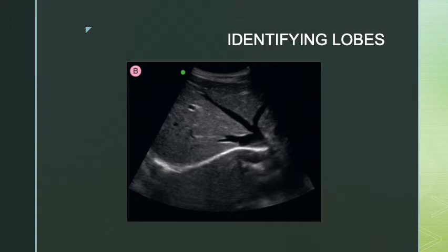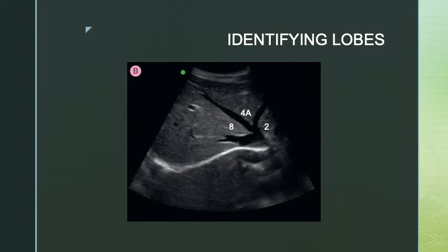You can see the middle hepatic vein, the right hepatic vein, and the left hepatic vein. The middle hepatic vein lies in the main lobar fissure, which divides the left medial lobe and the right anterior lobe. With our image orientation showing right, left, anterior, posterior — we have segment two (superior lateral), segment four A (superior medial), segment eight (anterior superior), and segment seven (posterior superior).